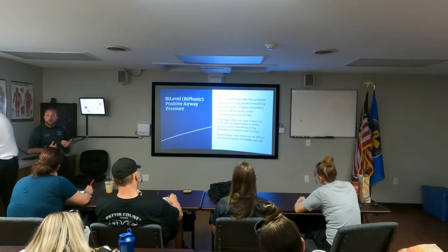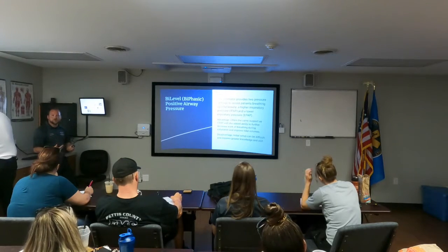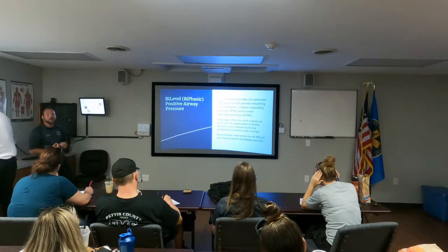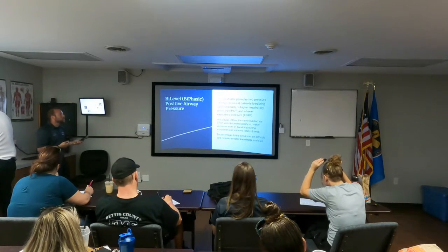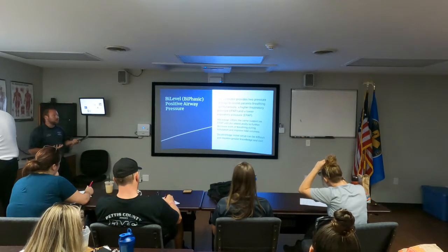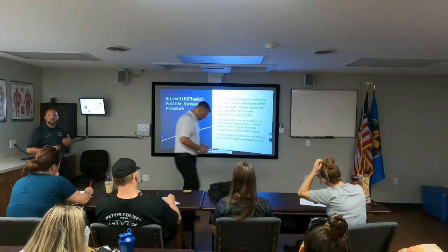That initial breath is going to be a higher setting of pressure to help drive that volume in. That lower pressure is going to keep that alveoli open so that we are always recruiting as much as we can so that it can do better. One of the disadvantages, and the thing that we see the most problems with, is its initial setup can be difficult and requires a greater knowledge of skill.